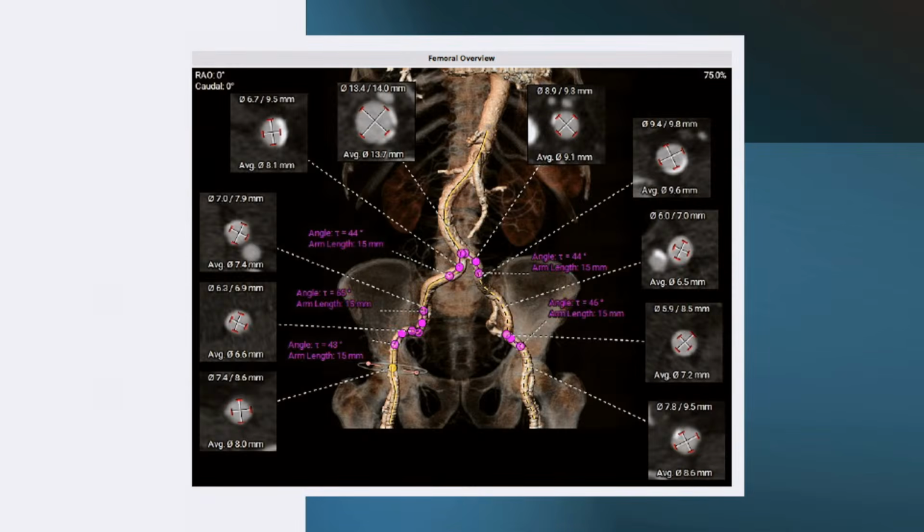On the left side, we can see there are some specks of femoral calcification in the anterior aspect. So we're going to avoid that, because deploying a closure device might not hold well. Understanding the femoral anatomy is more important here, because vascular access plays an important role in having a successful procedure. So deploying the Perclose devices will be more important.